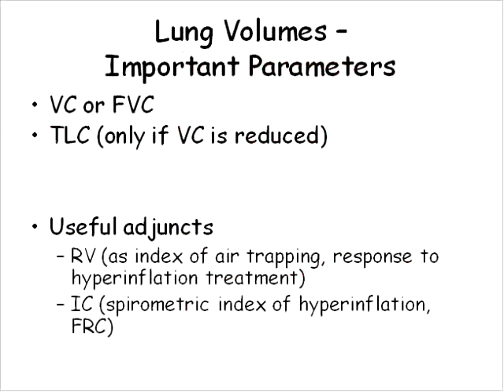There are some useful adjuncts, and again, if you measure total lung capacity, then you have a way of getting at residual volume. And residual volume seems to be coming into its own as a marker of how bad or how responsive lung disease may be in patients with airway obstruction. There's some literature to suggest that measures of gas trapping, such as the residual volume, are actually as sensitive as the FEV1 if we're trying to explain why the patient has symptoms or whether those symptoms get better following inhaled bronchodilator, for example.